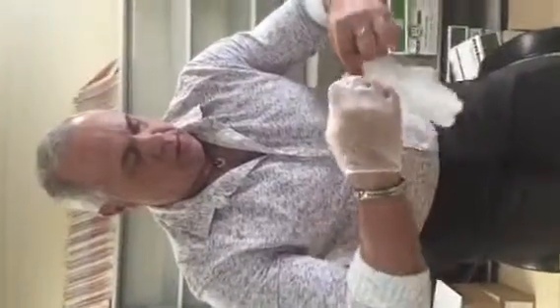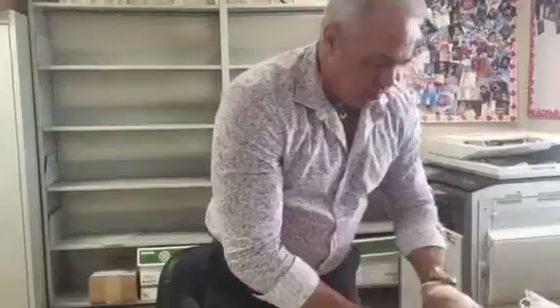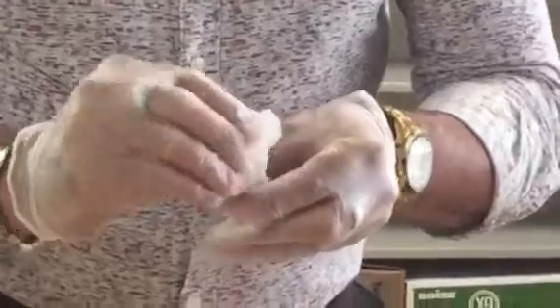Now, we are going to demonstrate how to do the correct process. Using the glove, we are taking the insulin bottle. We have to wipe the top of the bottle with an alcohol wipe and let it dry.